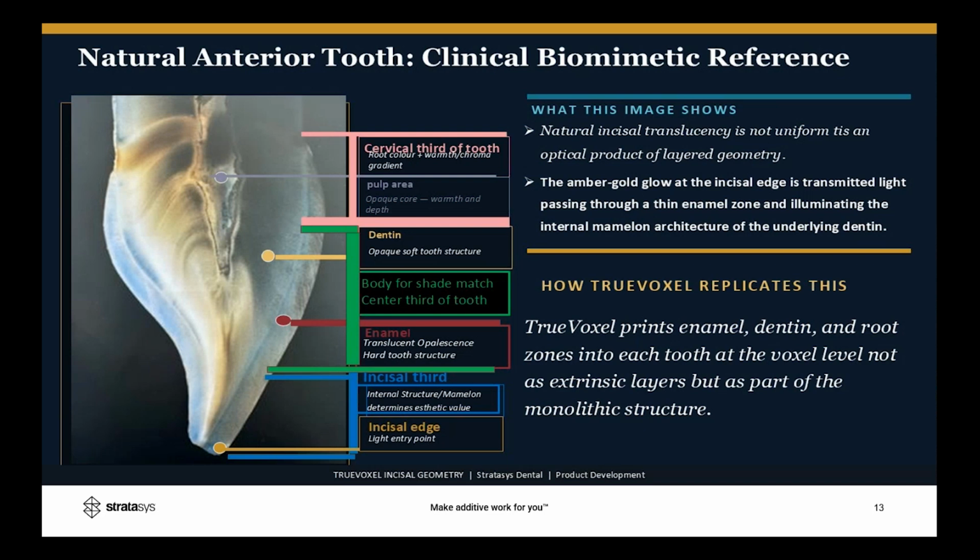So there's a lot of content in these 3 slides I'm presenting, but I'm not going to go through it word by word. I put a lot of content for you for reference so you can review them later on.